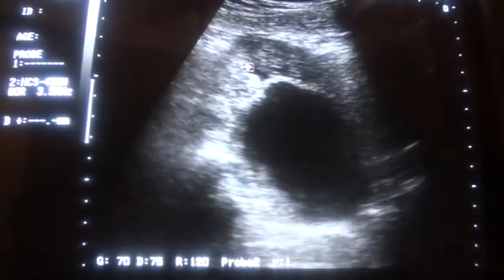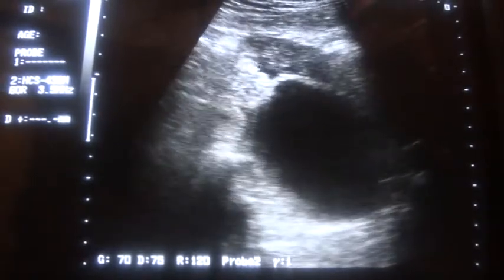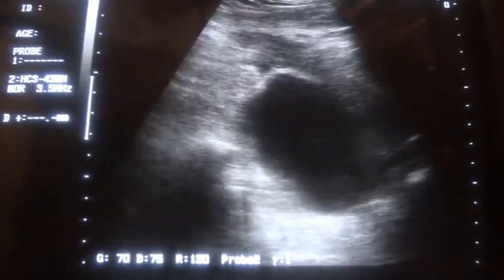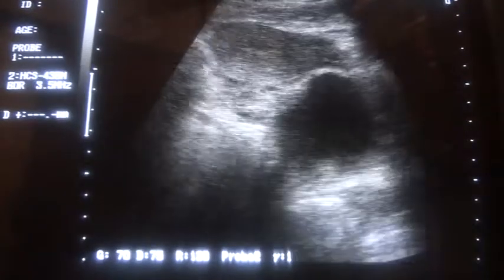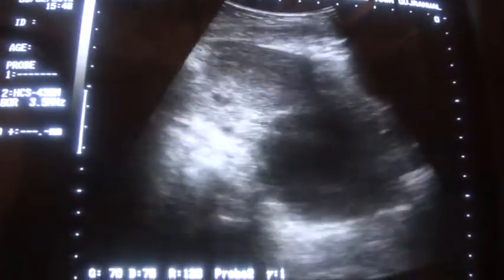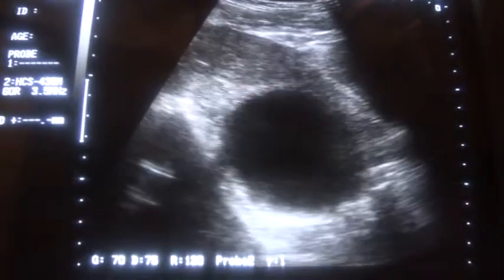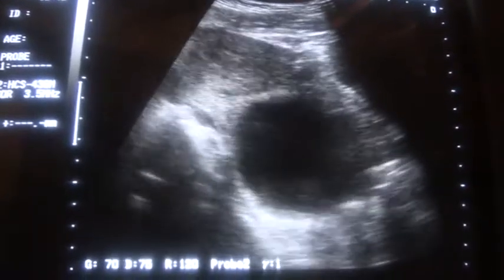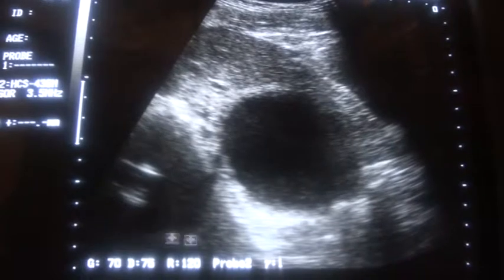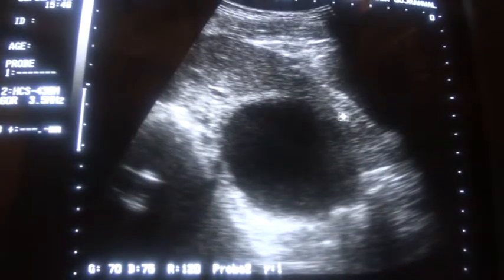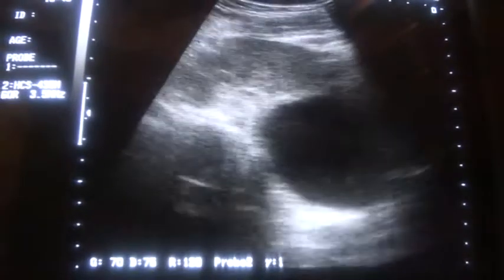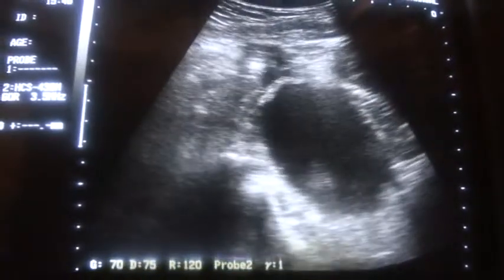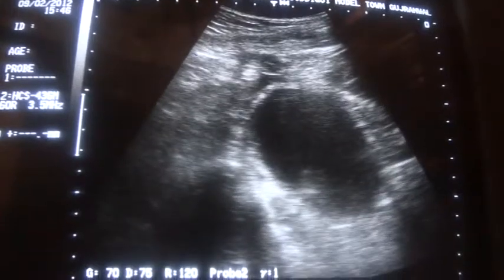And if you see, a small amount of fluid can be seen. This is the fluid. The patient is in severe pain, appreciating pain with the cystic area, relating to the left ovary elevating the posterior segment of the uterus. The cyst is elevating it with minimal fluid around — this is suggestive of torsion ovarian cyst.